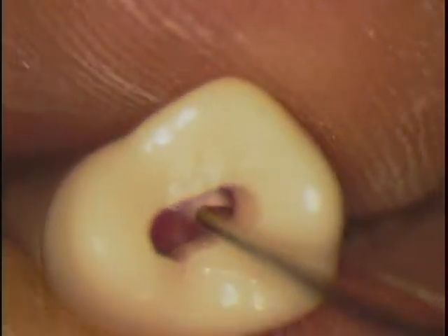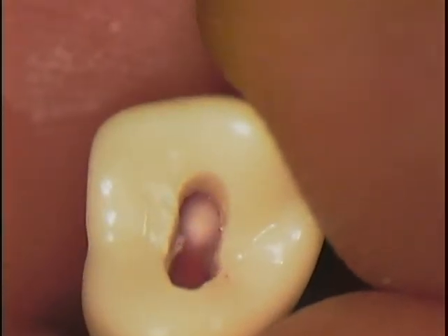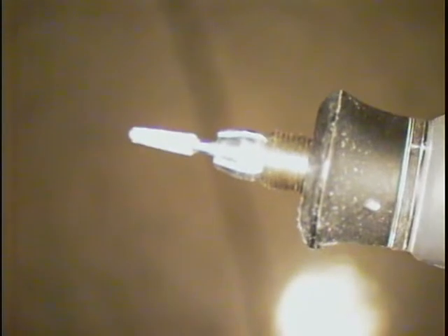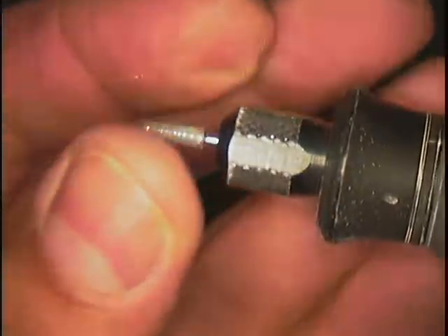So getting rid of my ledges, that's the next step. I might feel more comfortable now in switching to my diamond burr, because now I know the diameter of my diamond, and the diamond is a coarse instrument in itself, so you'll probably get a little more cutting action in there. So we'll change your collets, change your burr. Let's put that all together. Let's see if that goes in like so. Again, I'm holding with my finger, tightening that down. Going to come right back in, low speed again, nothing too heavy here. Okay.